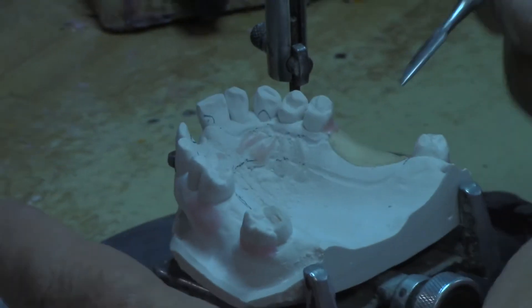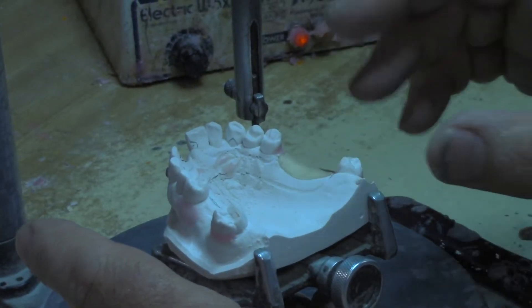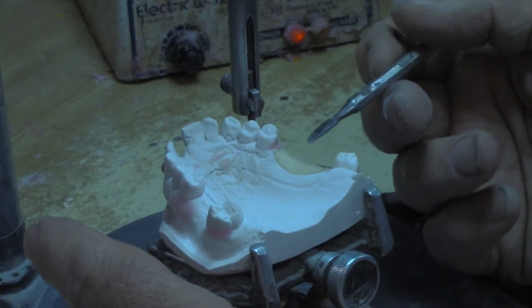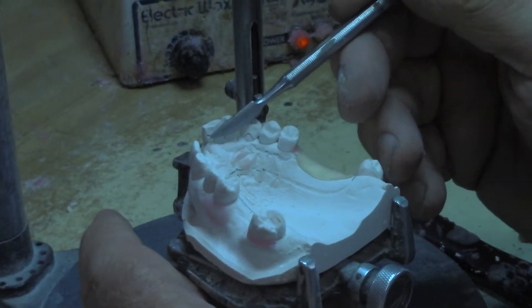I'm going to place 22 gauge sticky wax and put it on there. That's for my retention relief for the mesh work on the partial where you're going to set the teeth. I'm not going to have any relief where that facing is, because that's going to be attached on the back.